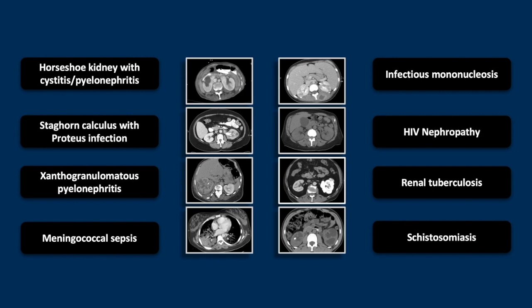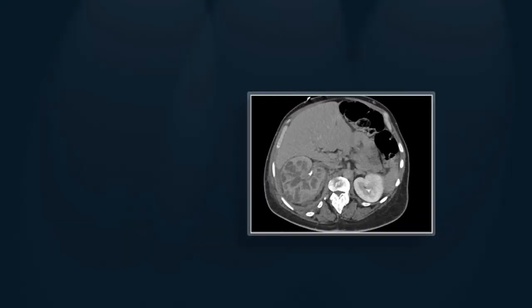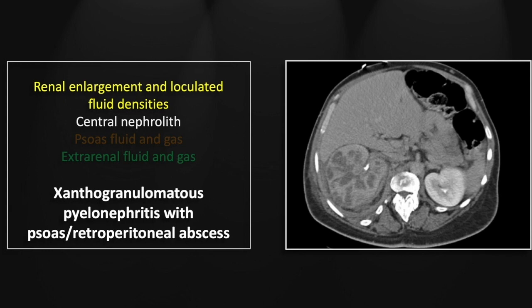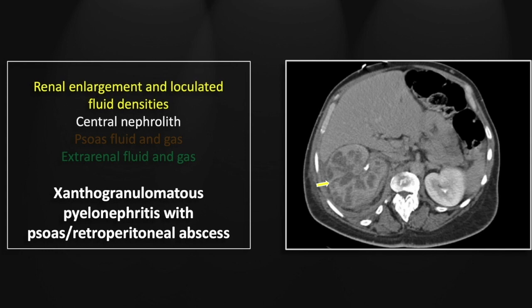Our next case is of xanthogranulomatous pyelonephritis. Essentially a classic case of XGP with marked enlargement of the right kidney, multiple loculated fluid densities within that expanded parenchyma, and a central nephrolith — a finding essentially required for this diagnosis.